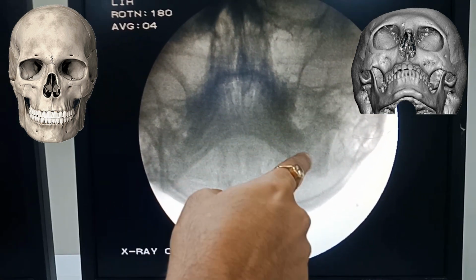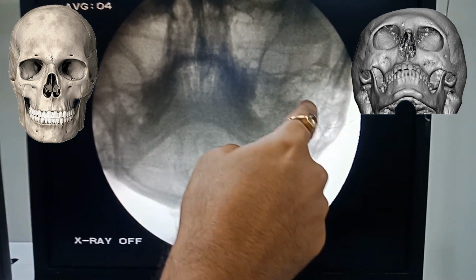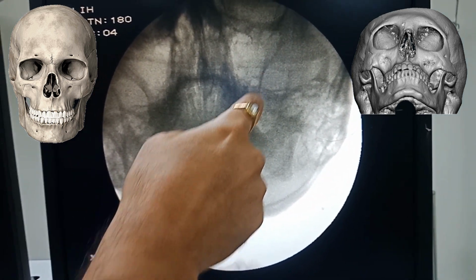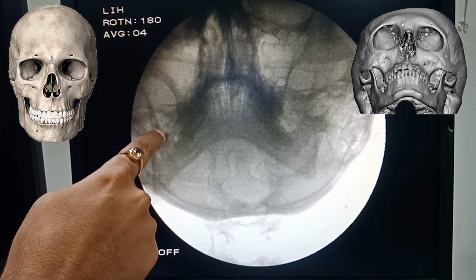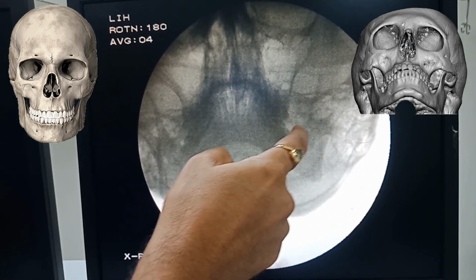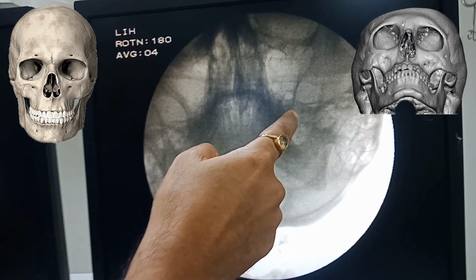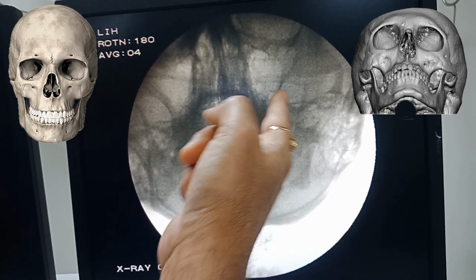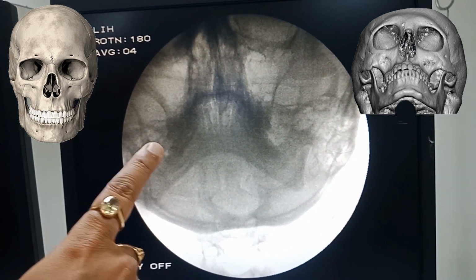So we can see the lower border of the mandible, the angle of the mandible, ramus of the mandible, lateral border of the maxilla. This is the space in between the anterior border of the ramus of the mandible and the lateral border of the maxilla. This is the space through which we can enter, we can reach the base of the skull. So this is the submental view.